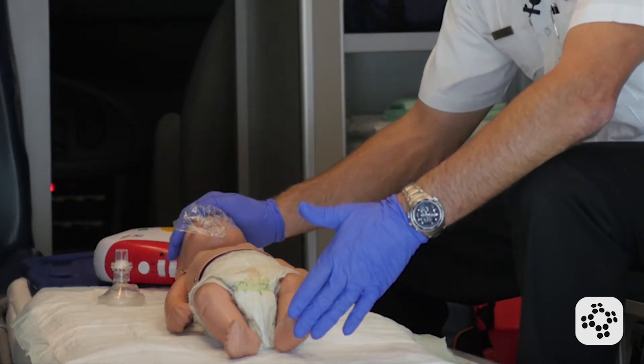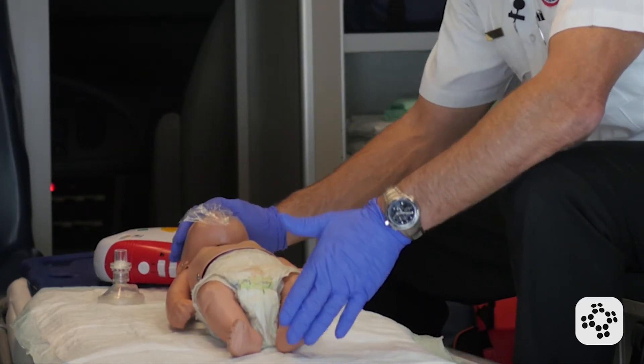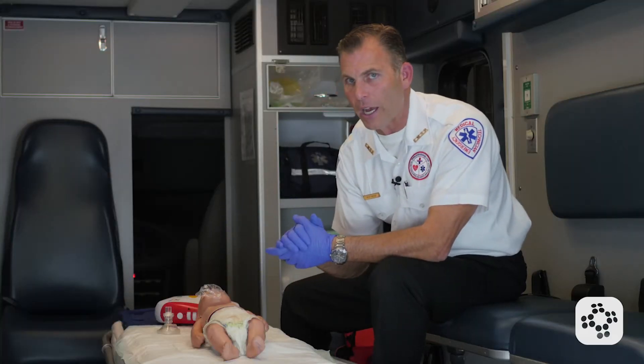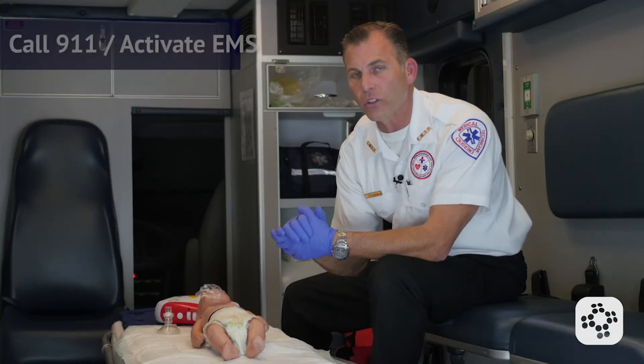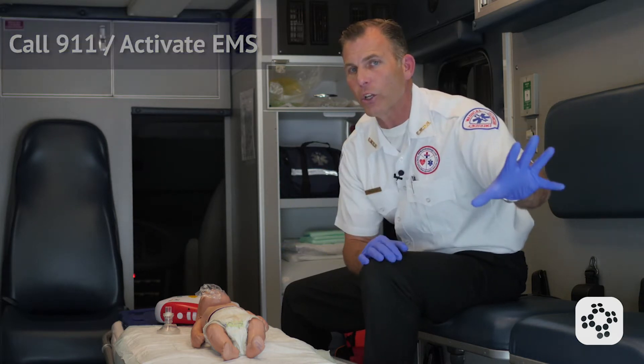We assess for responsiveness: 'Baby, baby, are you alright, are you okay?' The baby does not respond, so we activate EMS — call 911 or call a code. If sending someone to call 911, we'd say, 'Hey, you in the plaid shirt, go call 911 and come back — I might need your help, and bring an AED with you if you can find one.'